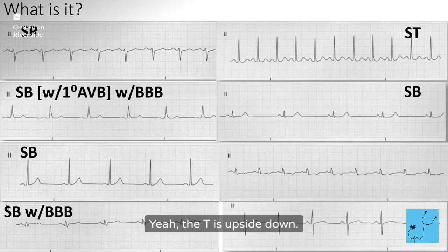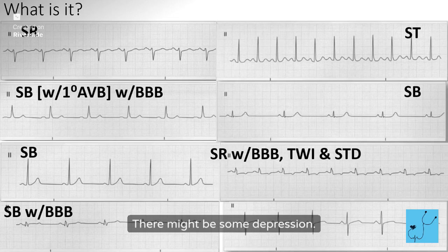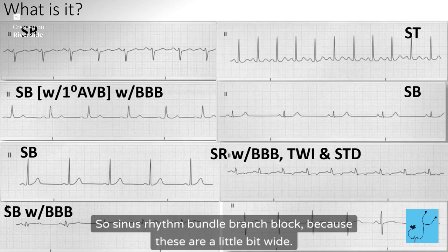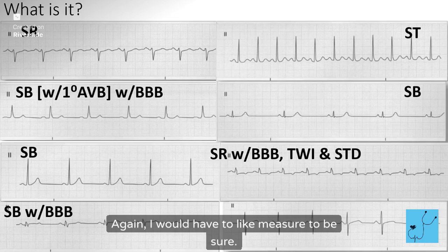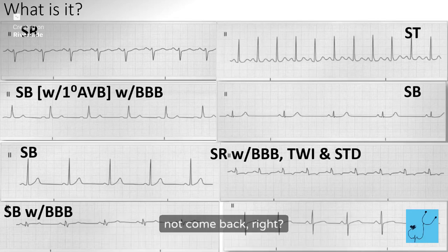Yeah, the T is upside down. Definitely, we have an inverted T. There might be some depression. So sinus rhythm, bundle branch block, because these are a little bit wide. Again, I would have to measure to be sure. T wave inversion. So our T waves are upside down, and maybe some ST depression, because it does not come back, right?